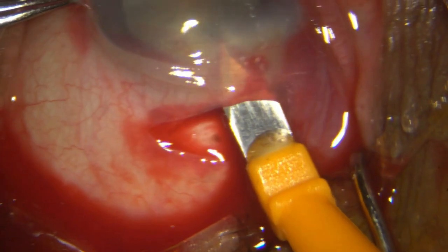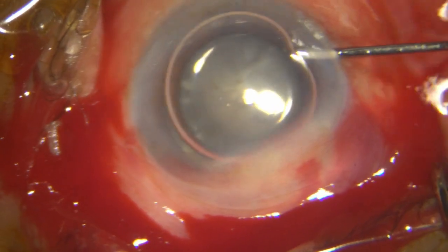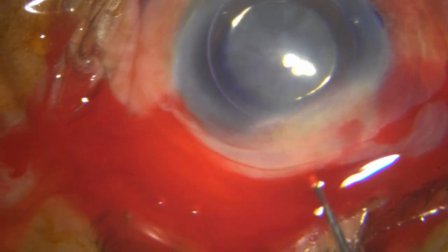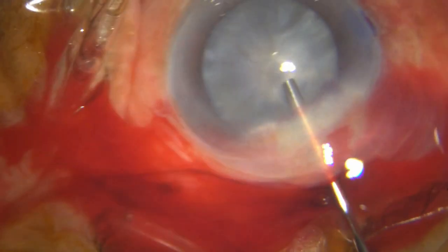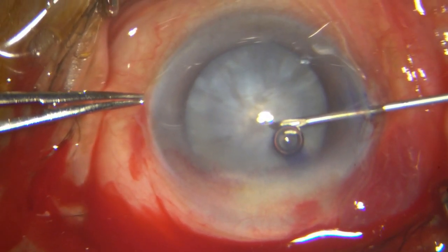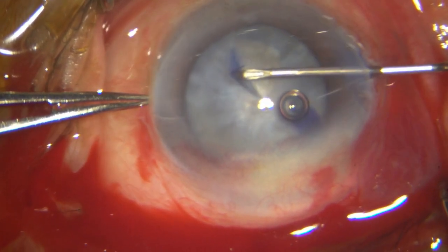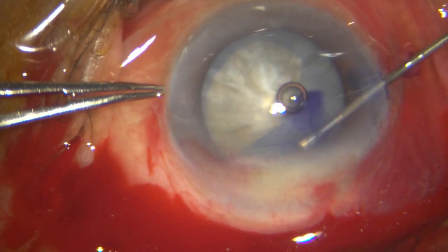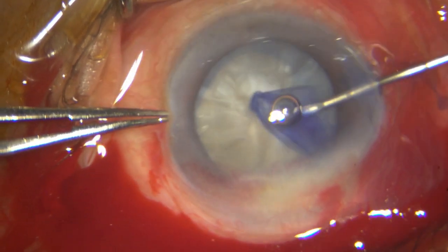So I put in my side port, enter with the keratome, stain the capsule with trypan blue, and I'm expressing both the trypan blue and the air bubble with 2% HPMC, and it's time to do my rhexis, which has to be big. This is probably a large brown nucleus. I've already done the other eye, and I didn't have so much bleeding in that eye, but just goes to show that not all eyes are the same.